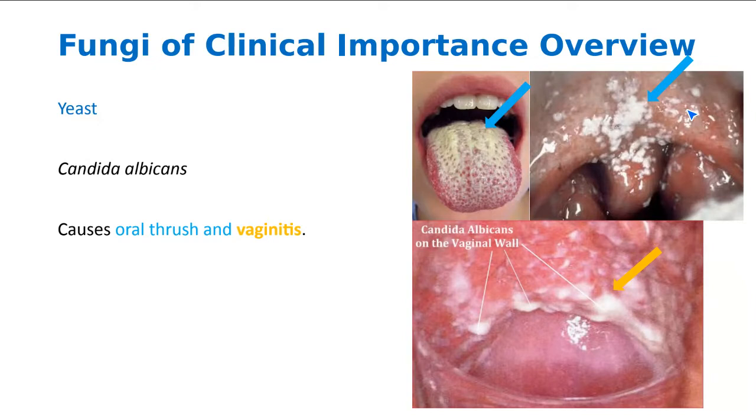And now the yeast have all this space to come back to. So that's typically what we would see with vaginitis, right? This is due to the antibiotics you might be taking. This one up here, not so much.